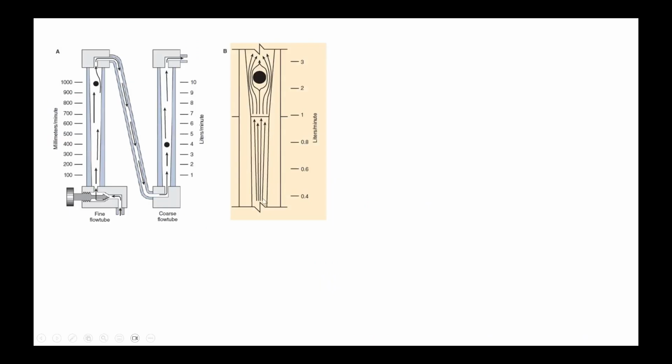Now coming to the flow meter part of it, which becomes the entry point of the low pressure segment, what is this flow meter? What is this? What is the difference between these two?